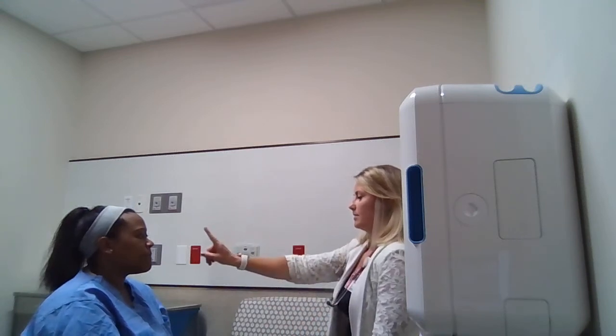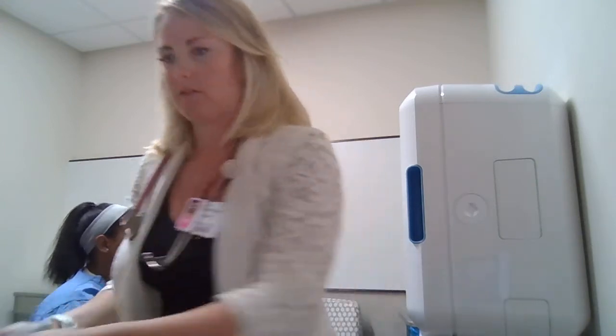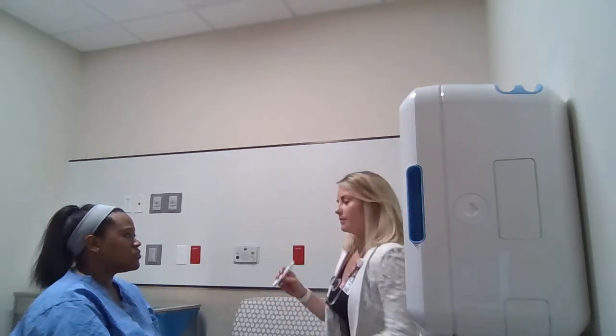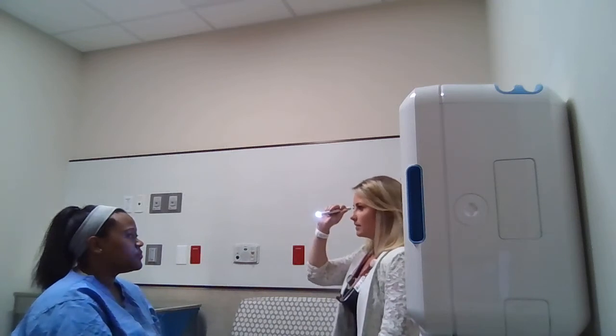Perfect, keep on following. All right, awesome. Now I'm gonna bring the light in here. Try to stay at least a foot away from you so it doesn't bother you too much. First, I'm just gonna shine it into both eyes at the same time and check for your corneal light reflex. So whenever you're ready, go ahead and let me know. Ready. Okay. All right, perfect.